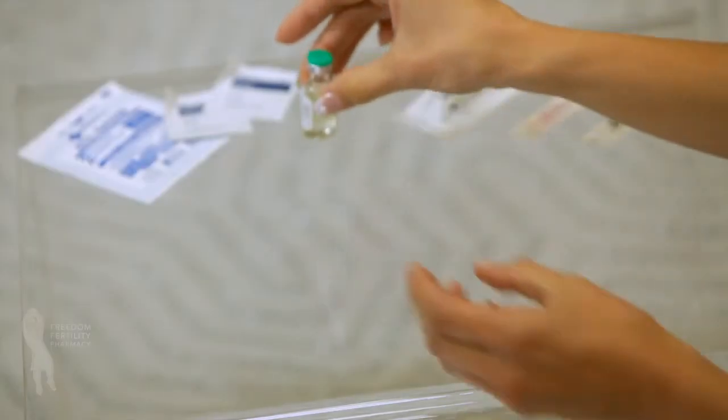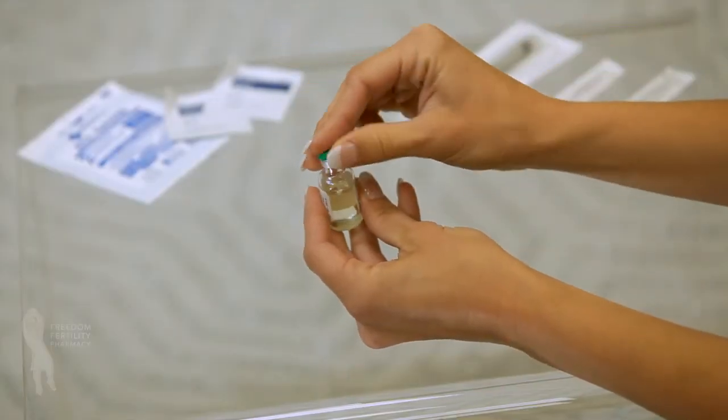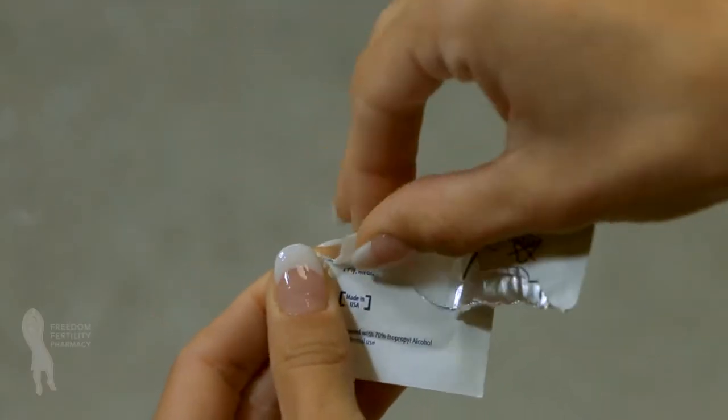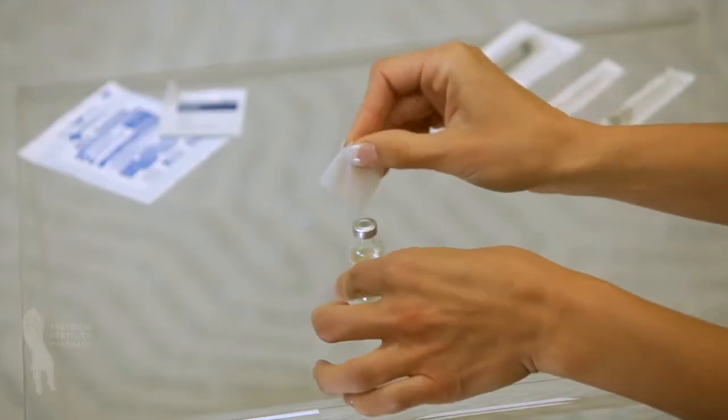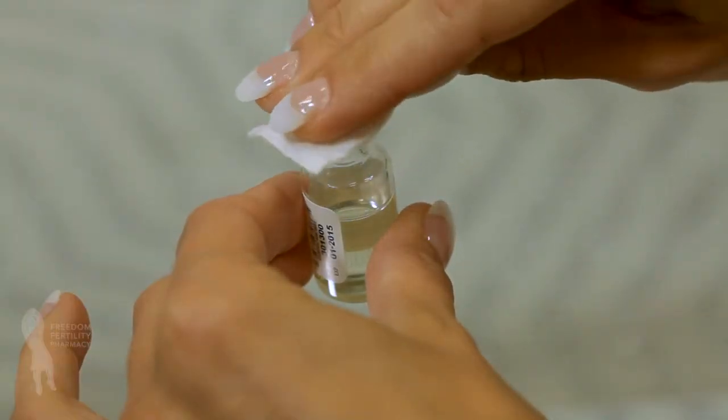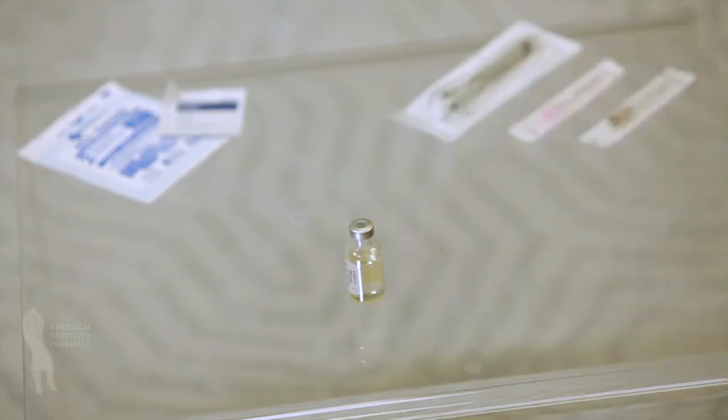If using the vial for the first time, use your thumb to flip the protective plastic cap off the vial of Delestrogen or estradiol valerate. Wipe the top of the vial stopper with an alcohol swab each time you use the Delestrogen or estradiol valerate. Allow the stopper to dry completely.